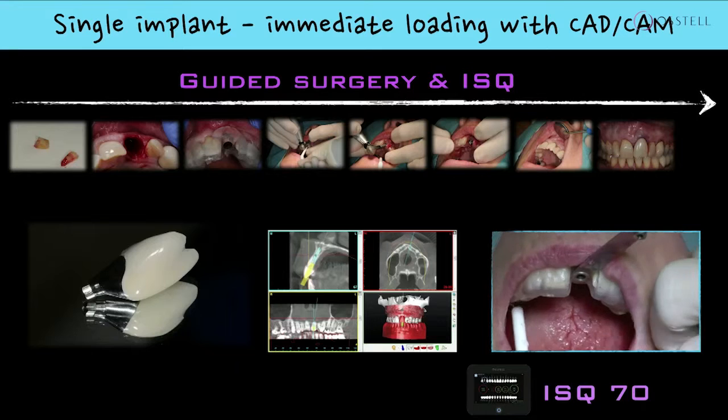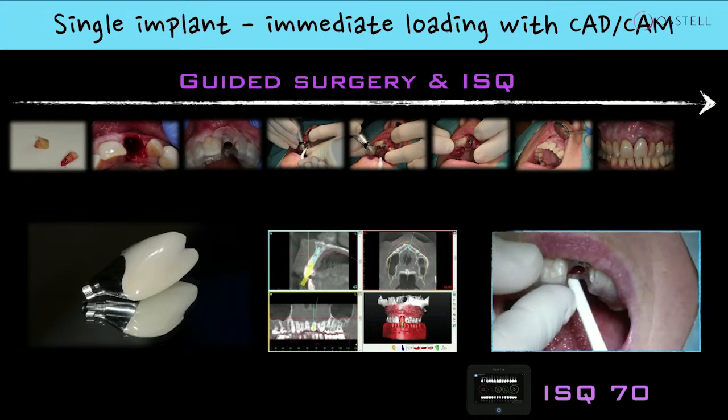So I have to measure by means of ISQ what type of decision I should take. We're aiming for immediate loading here, and this is a nice value — it's a high value of ISQ. So that gives me the confidence to go further with the patient and respect the patient's wishes.